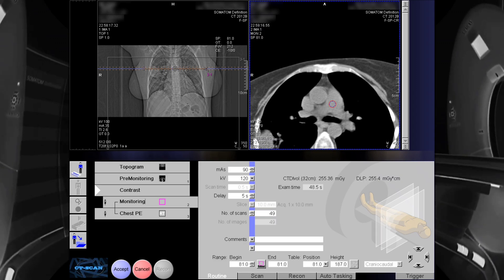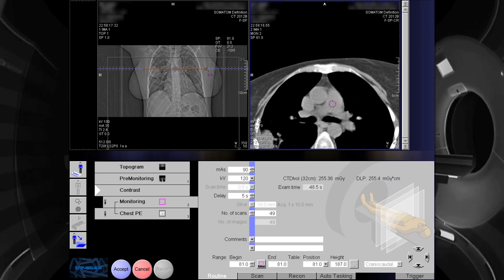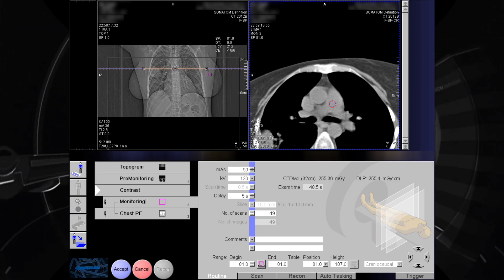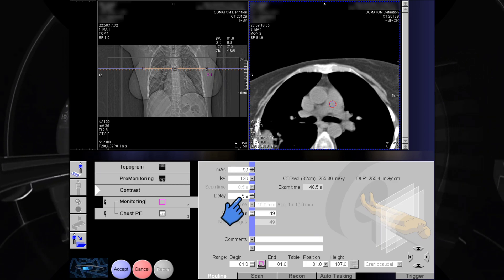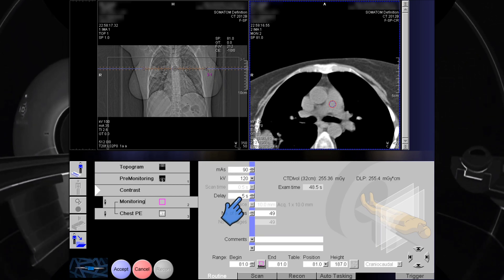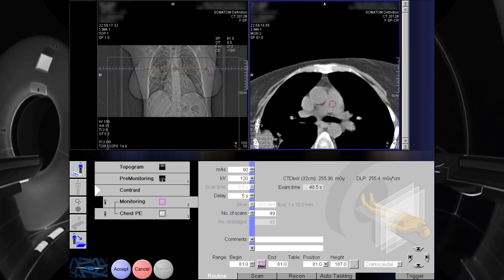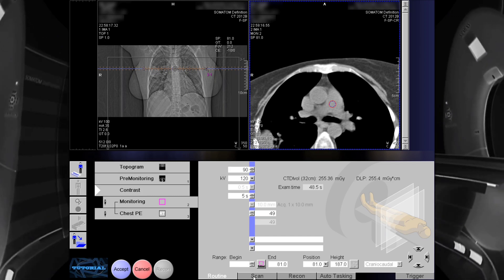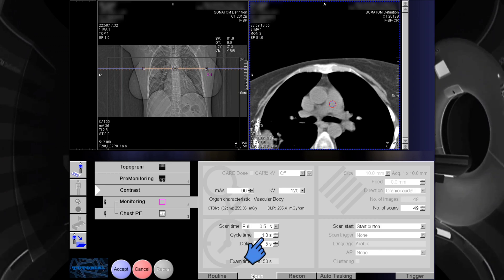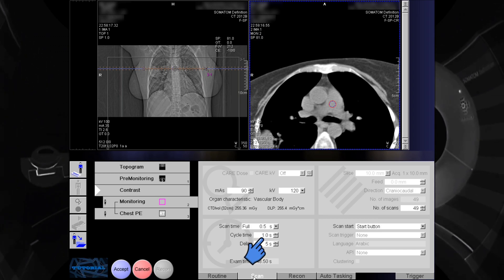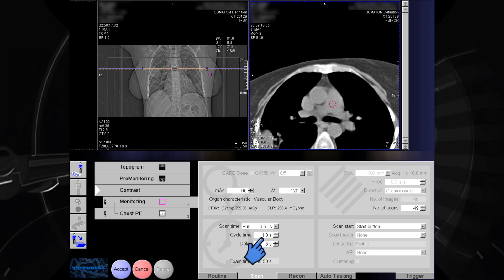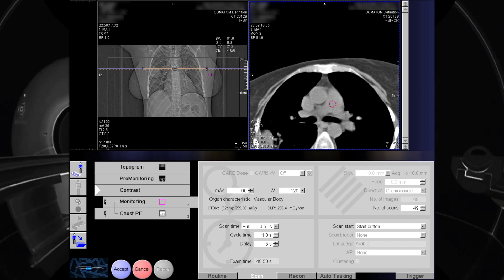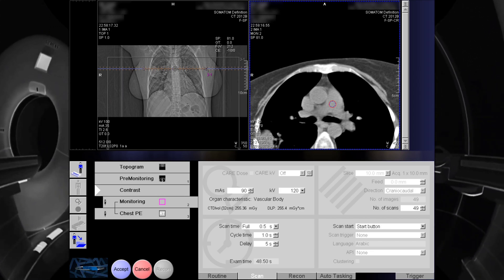Now, we will move to the next step — the monitoring. Here, we are going to set the delay scan and the cycle time. We are going to put 5 seconds scan delay to prevent unnecessary exposure to the patient. In this section, we will find the cycle time, which is the time interval of each scan in the monitoring. We will set the cycle time to 1 second since the passing of contrast in this area is fast.